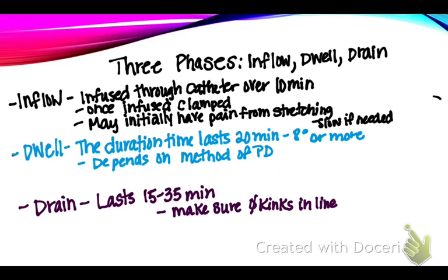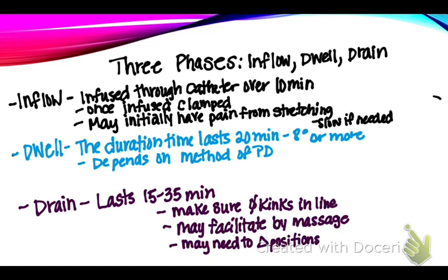And then the drain lasts 15 to 35 minutes. Make sure there's no kinks in the line. You can facilitate drainage with massage. Sometimes they need to change positions. So that's the drain phase, when it's draining out.